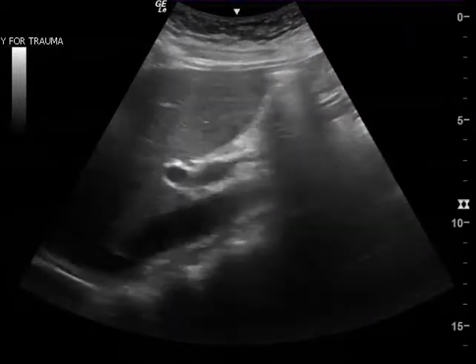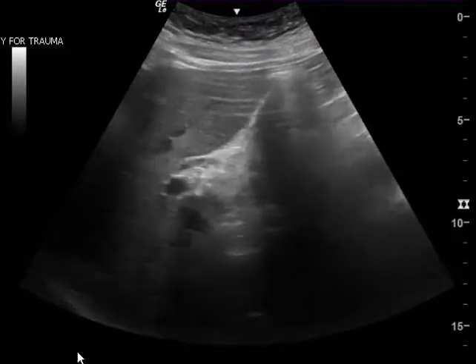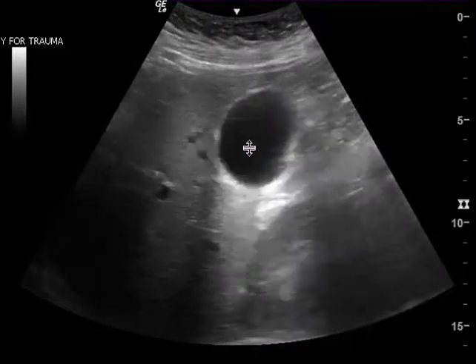This is the last clip, and in the beginning as I was watching this I didn't see gallstones originally. You have a great view of the fundus or the body of the gallbladder right there.